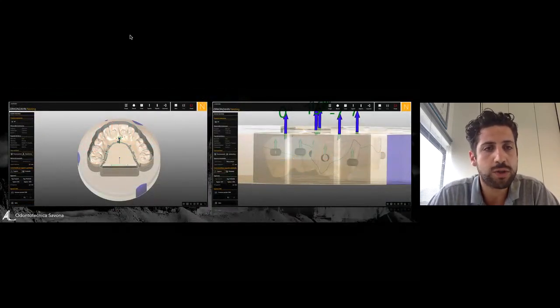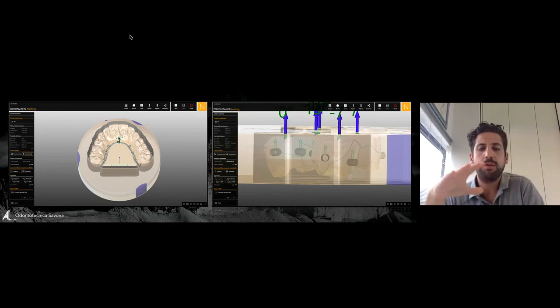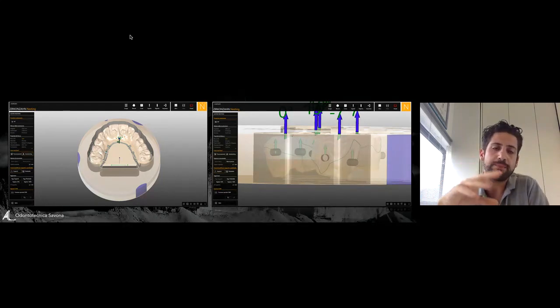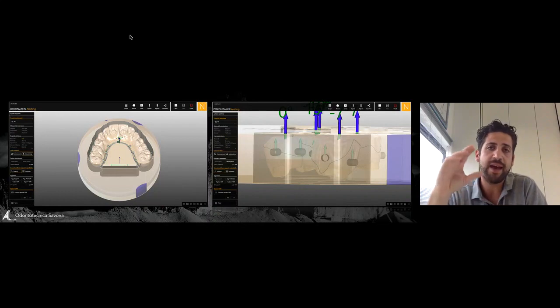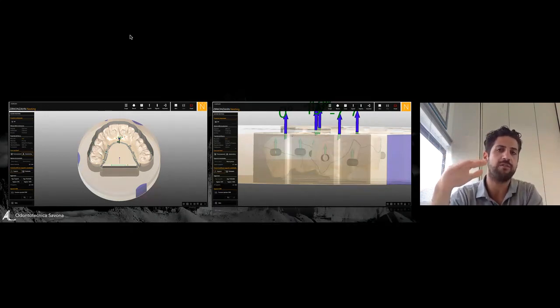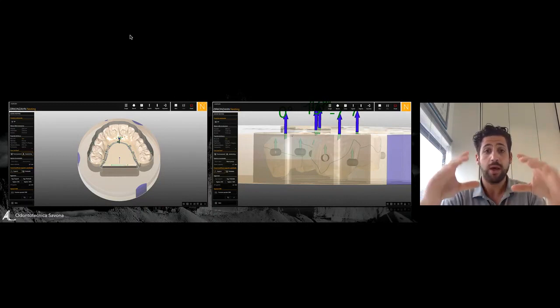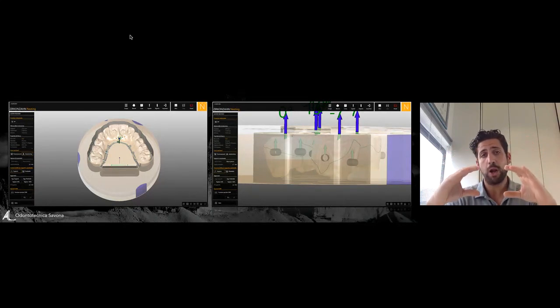We can also see the importance of the nesting, because with this zirconia we can decide the chroma and the incisal part of the crown. For example, if we have a full rehabilitation, more or less we use the full space of the blank. But on the right side, you can see the single unit. If you decide to put the crown a little lower, we get a little more chroma. If we put the crown a little higher, we get a little more incisal edge, and so more translucency.